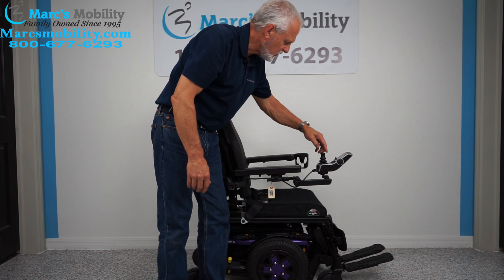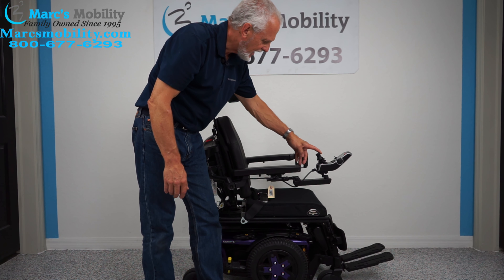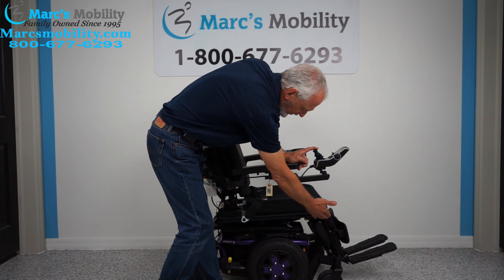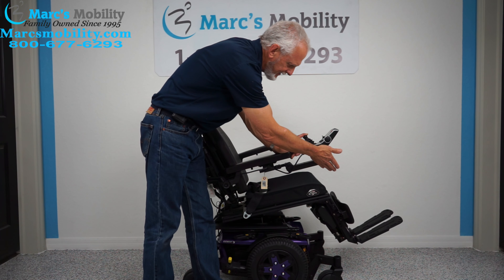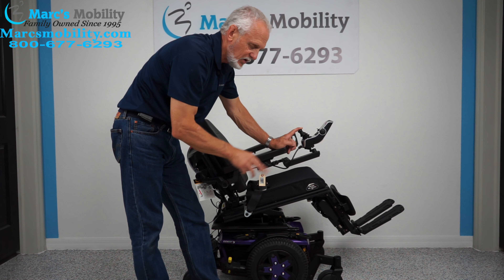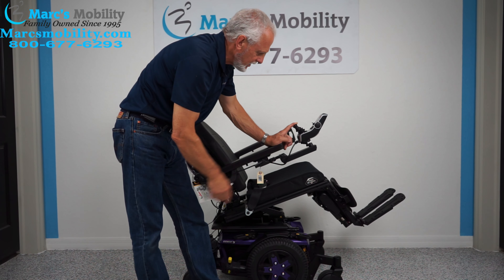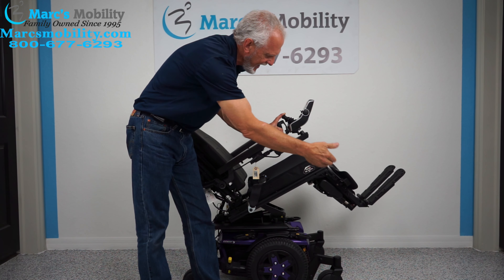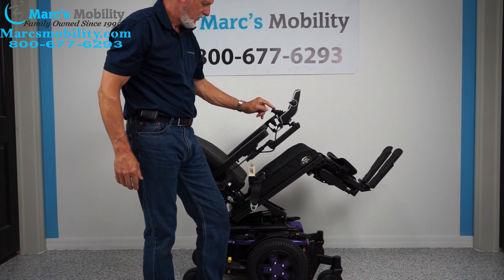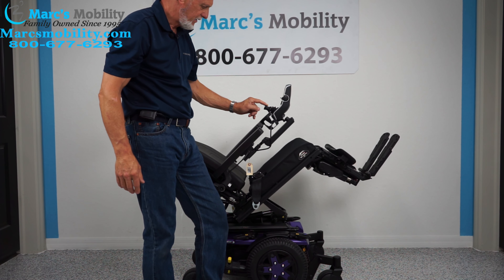Once you have that picture there, you just push the joystick back and you can see the base right here — this is called the tilt — this portion goes back. As it goes back, it's going to take the legs and the back because they're all connected together. These feet are electric and we can adjust the length of them. So this is your electric tilt.